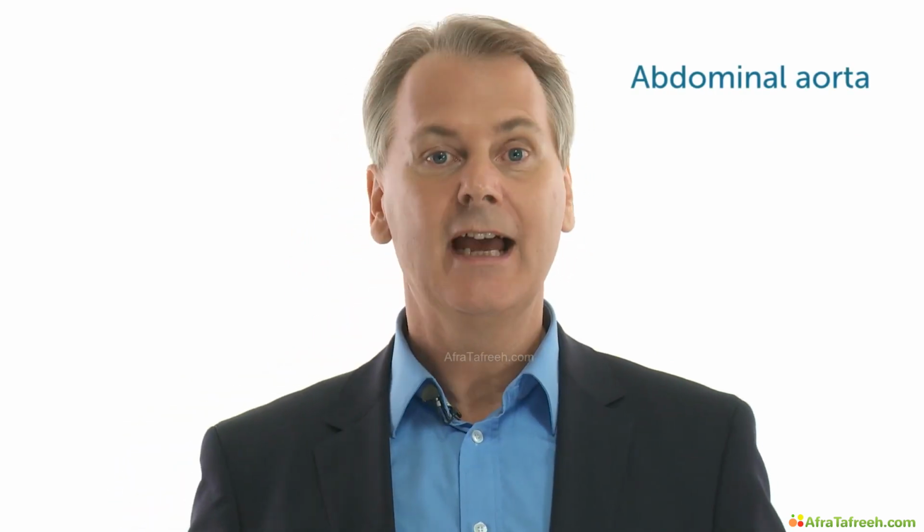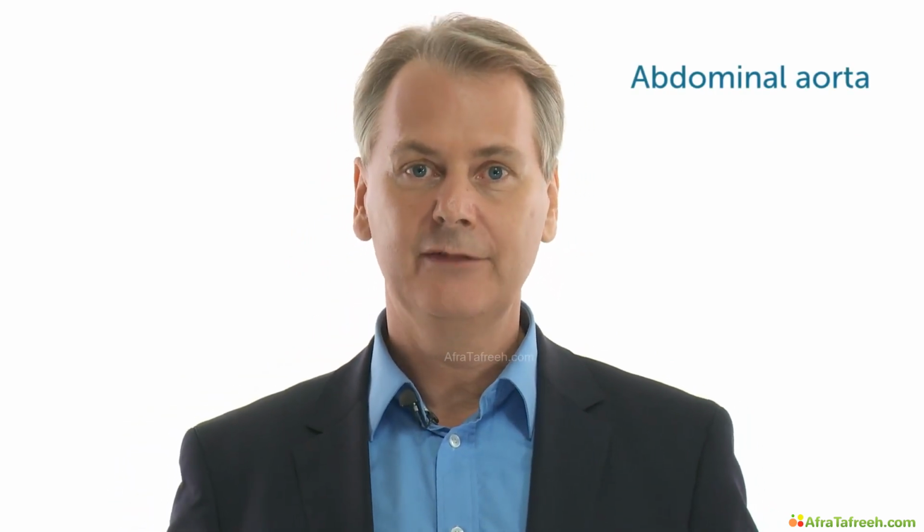But should we cross the border of the diaphragm and go and see the abdominal aorta? Well, Anna, I think this is a very good question. I mean, after all, we have a transducer in our hands, and even if it's not the abdominal transducer, we are able to visualize the abdominal aorta as well. So let me show you a case that highlights the potential of this.